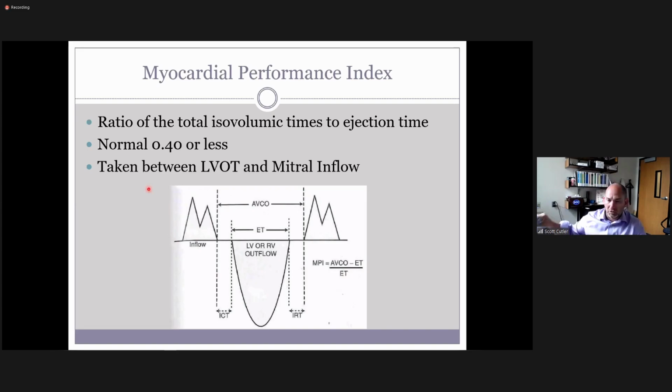Then, if you needed to, on your ultrasound machine, you could just pull it out and step out of the room for a minute, look up stuff, and make sure you're getting what you need. But honestly, the MPI, from my scanning experience, is something we never did in our lab. Some labs might be doing that. Some of these measurements, you could ask Tyler how much he used it. I'm doubtful that it's a very commonly done measurement.